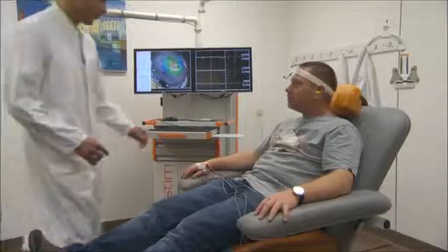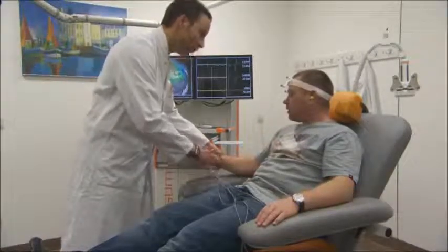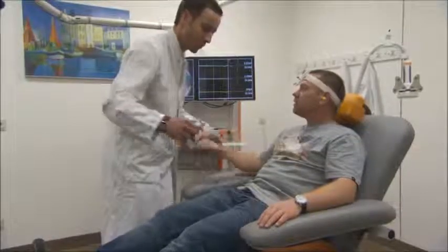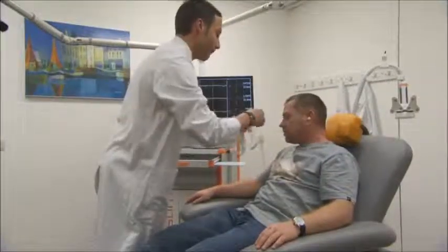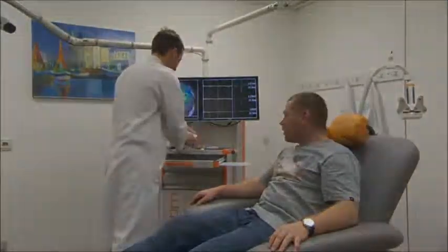The results are explained to the patient, and the implications for treatment are discussed. The NBS mapping results are exported to the surgical planning software. For fiber tracking, the NBS results give a reliable physiological basis for selecting the seeding points.